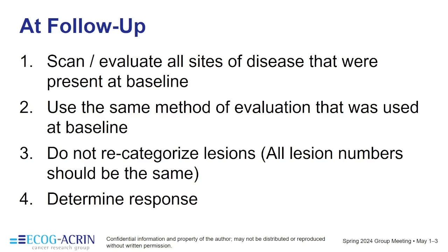One of the exceptions is CT scans to PET CT scans, where if you're using the CT scan of a PET CT and it is considered the same diagnostic quality as the previous CT, as a plain CT, it can be used interchangeably, but you may get queries from data management asking you to confirm that that is the same quality as a CT.